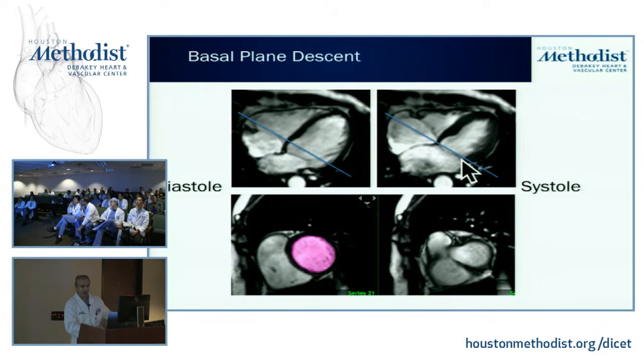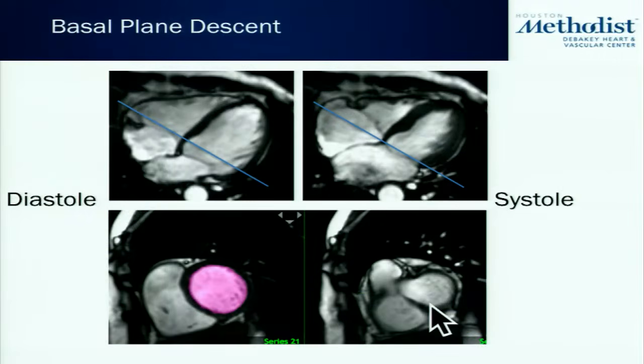Now the question you've got here, which is a good one, is if I look at this slice right here, these are 10 millimeter slices, so half of it's below and half of it's above, right? So there's 2 ways to do it. There's one way, which is a manual way, where I would say, okay, for this slice right here, I'm only going to take whatever the volume there is and just trace half of it.